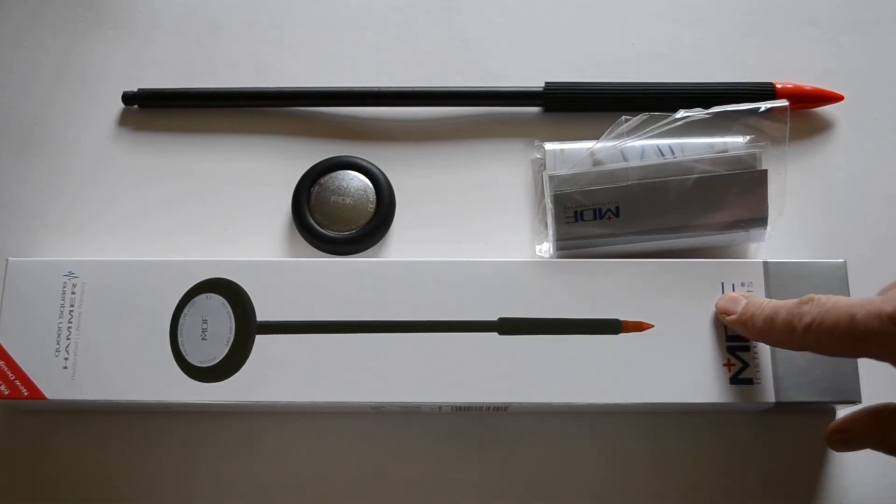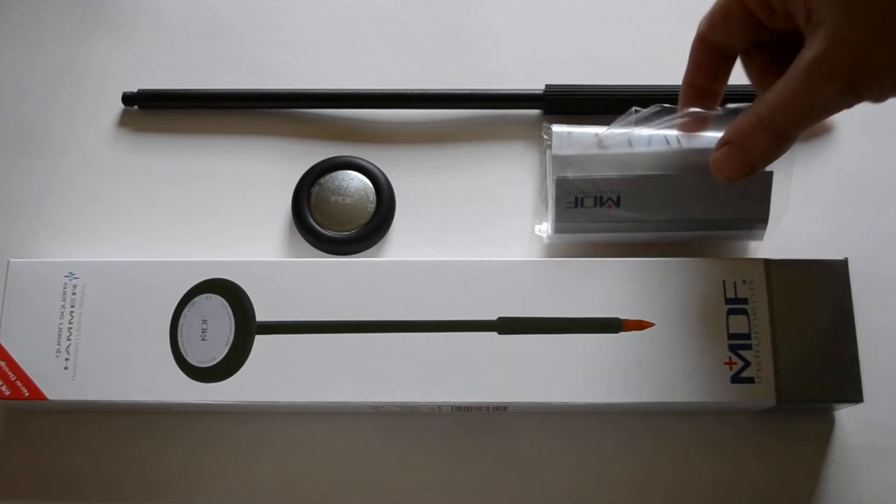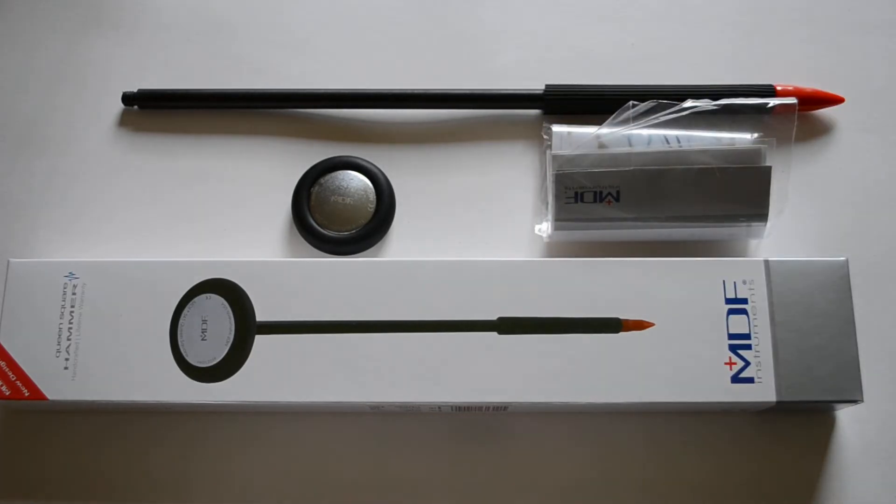Here we show you the actual packaging as will be presented to you. You get a presentation box and an MDF insert, which is basically just an MDF catalog showing you the certification of the unit.